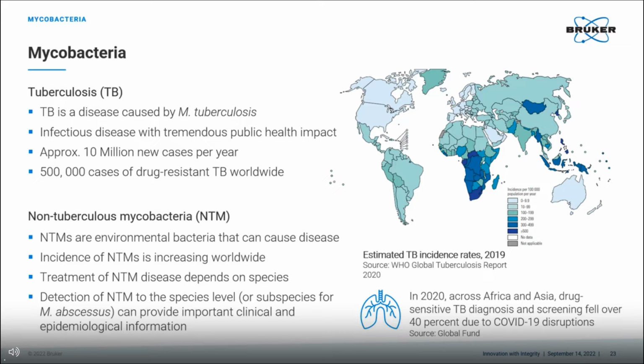And there's also non-tuberculous mycobacteria. These are environmental bacteria that can cause disease, and the incidence of non-tuberculous mycobacteria is increasing worldwide, with treatment of NTM disease dependent on the species, and detection of NTM to the species level can also provide important clinical and epidemiological information. So there are two clinical questions, I guess, in the mycobacteria space that we're looking to answer here.